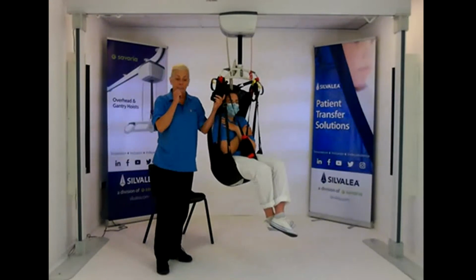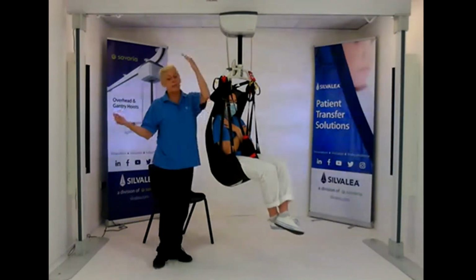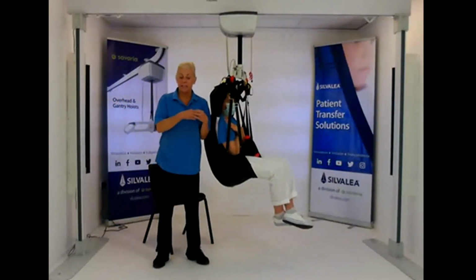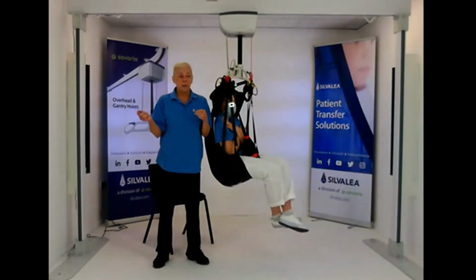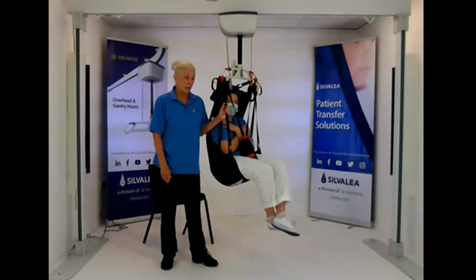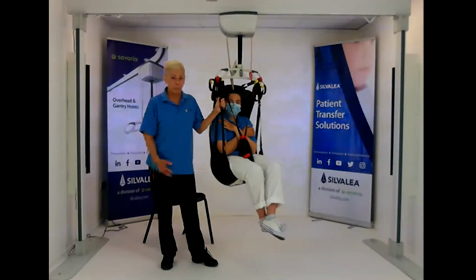But sometimes I had one with this certain style. They were applying it on the bed, and they needed to lower the spreader bar down to almost get them into a seated position before they finished the application of the other tapes, because they didn't have a profiling bed. So it depends on each situation and each policy for the organisation. I wouldn't say there's a hard and fast rule. It just depends on what you get used to, what you're comfortable with, and what works.